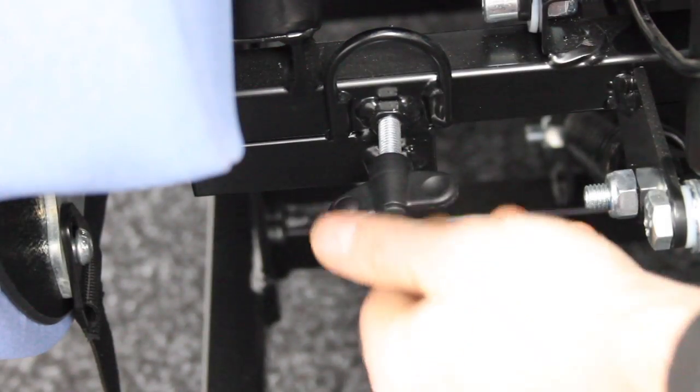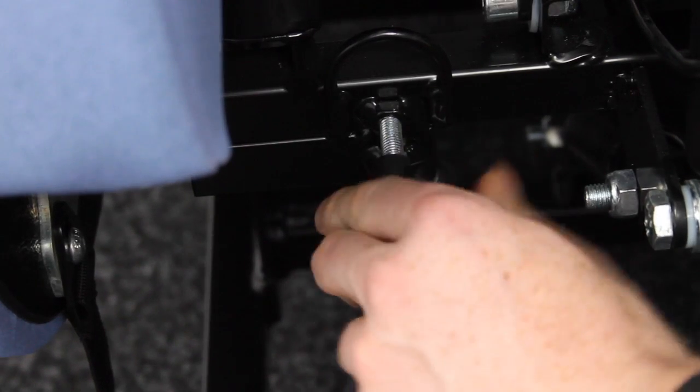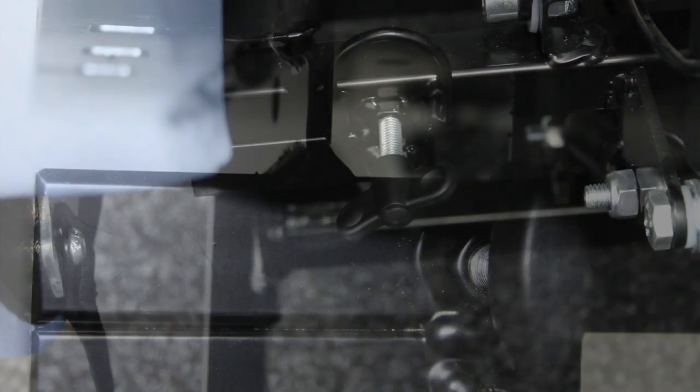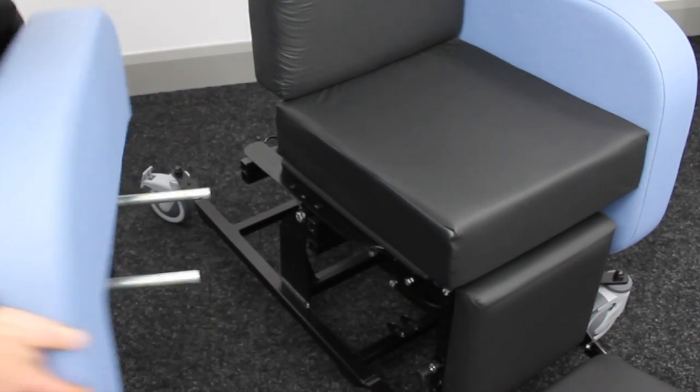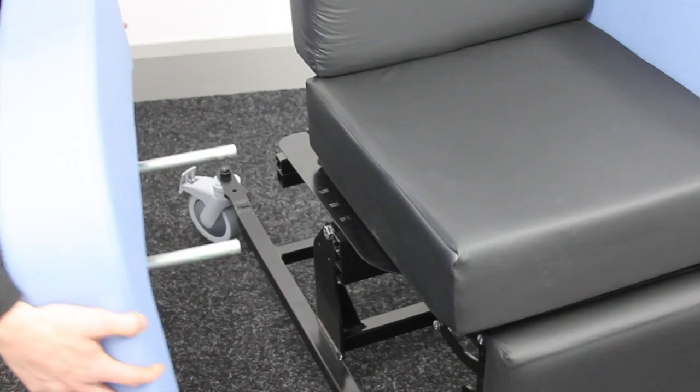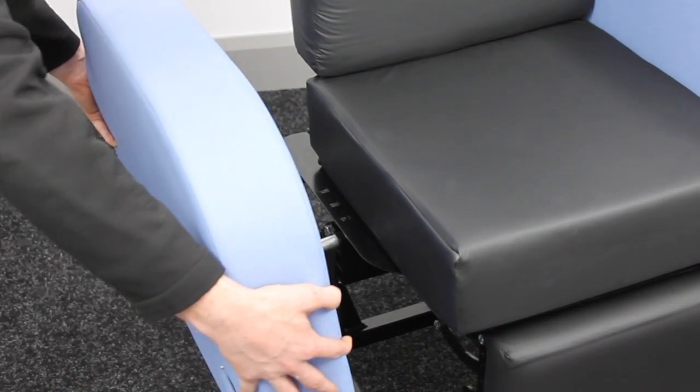To remove the arms, loosen the thumb screw on the back of the seat panel and also at the front. Once loosened, the arm can easily be removed. The arm bracket poles are different lengths, meaning the arms can be replaced with ease.